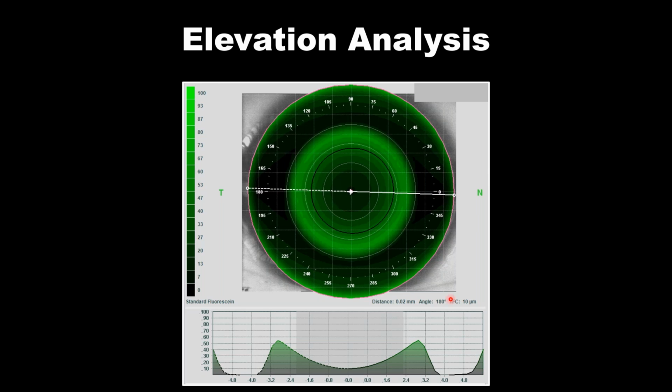This is showing you down on the graph what's called the tear layer profile. You must become a master of the tear layer profile when using contact lens software like a corneal topography platform or an EyeSpace platform. And what you're looking at is our edge lift at 9 o'clock, then our landing, then the reservoir of the reverse curve, then your apical clearance, and then the other side of the contact lens. So by taking this axis line 360 degrees around, you begin to understand the lens to cornea relationship.